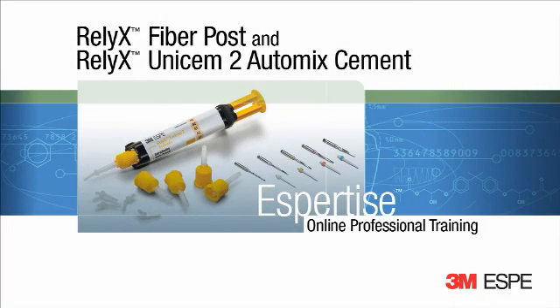The 3M ESPE RelyX Fiber Post System is indicated for endodontically treated teeth with significant loss of tooth structure to increase stability and retention of subsequent coronal restorations.